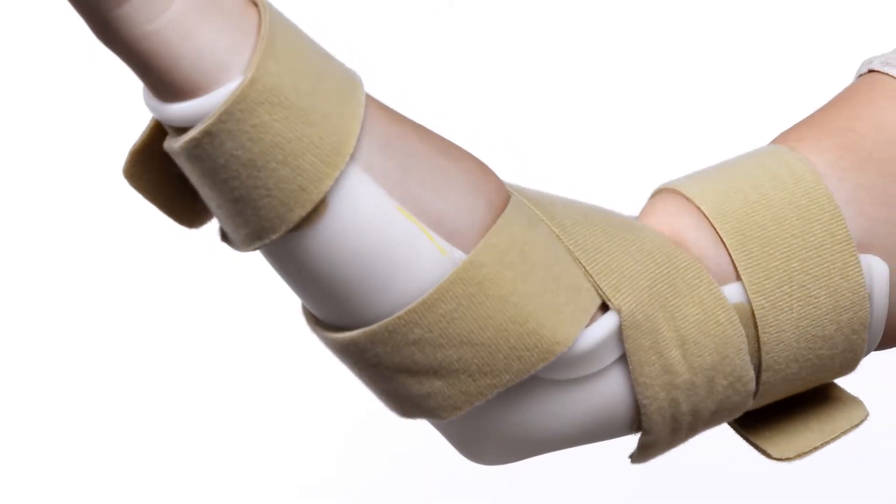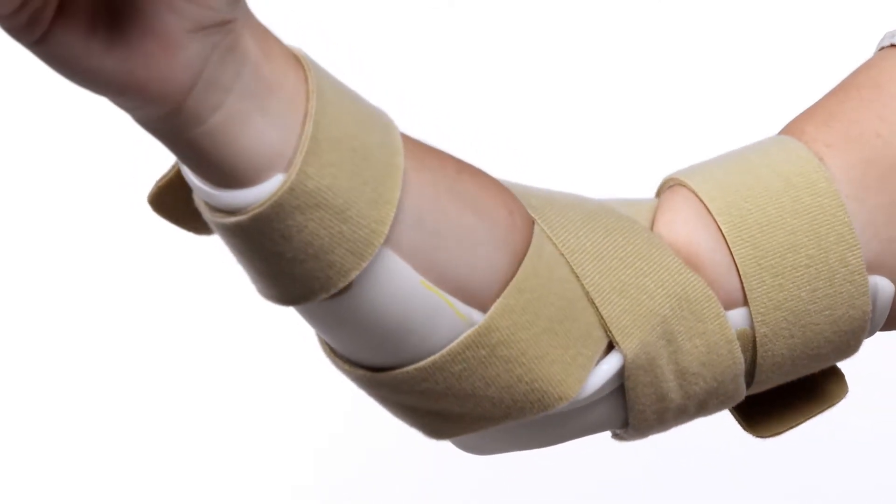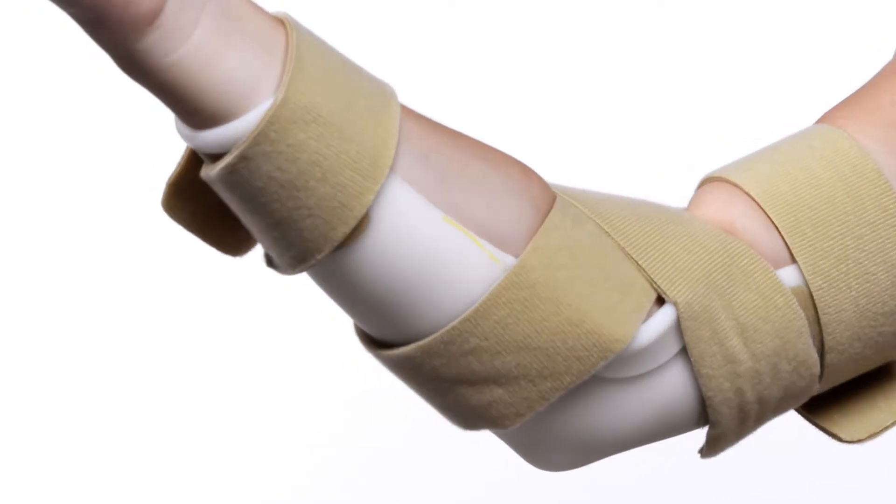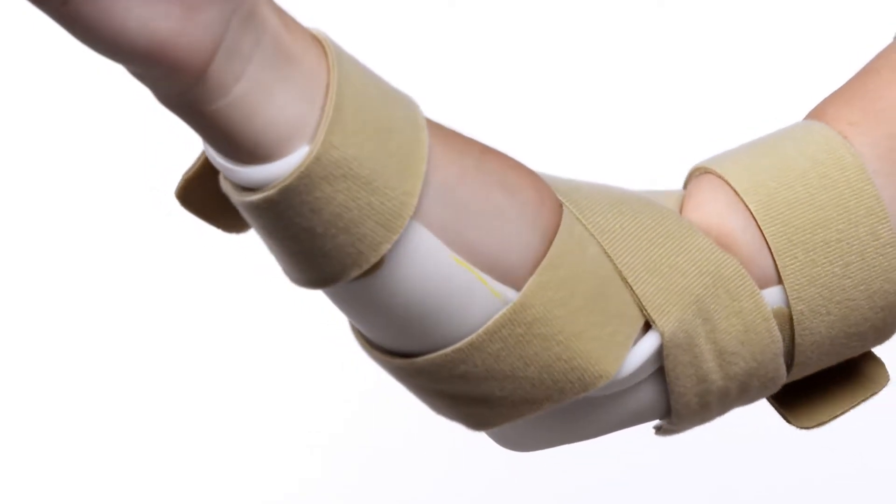Today we're going to show you just how easy it is to create a static elbow orthosis fabrication using Rolion splint materials.